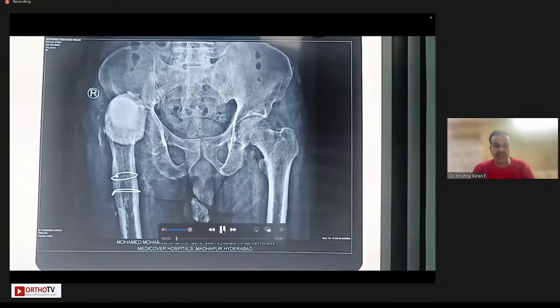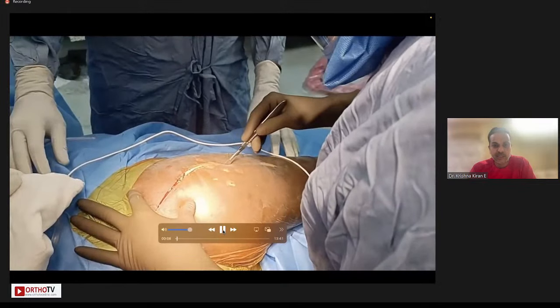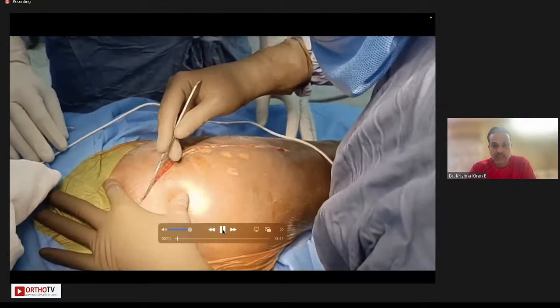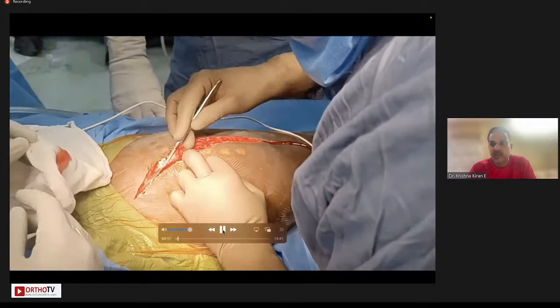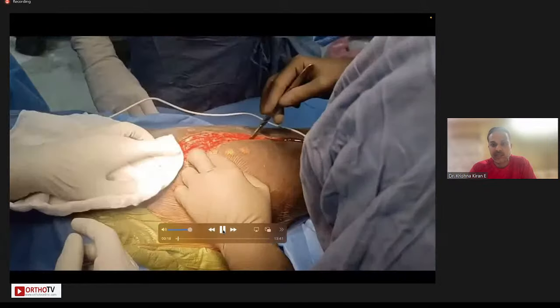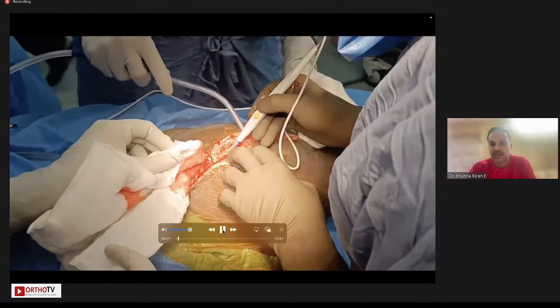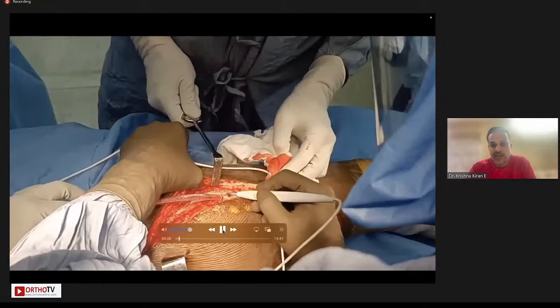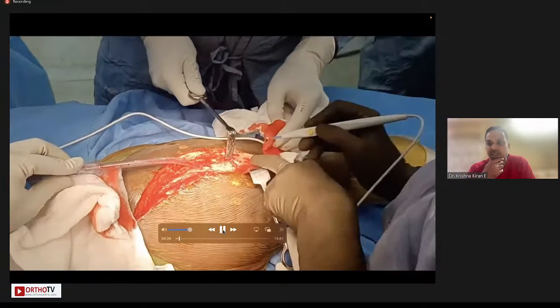So this is a case with a 3A type of defect, multiply operated, and you can see that there is a superior defect. So hopefully we'll try and show you how to expose the acetabulum adequately without damaging the superior gluteal neurovascular bundle. So in these cases, we do a more Gibson type of approach rather than a conventional posterior approach.